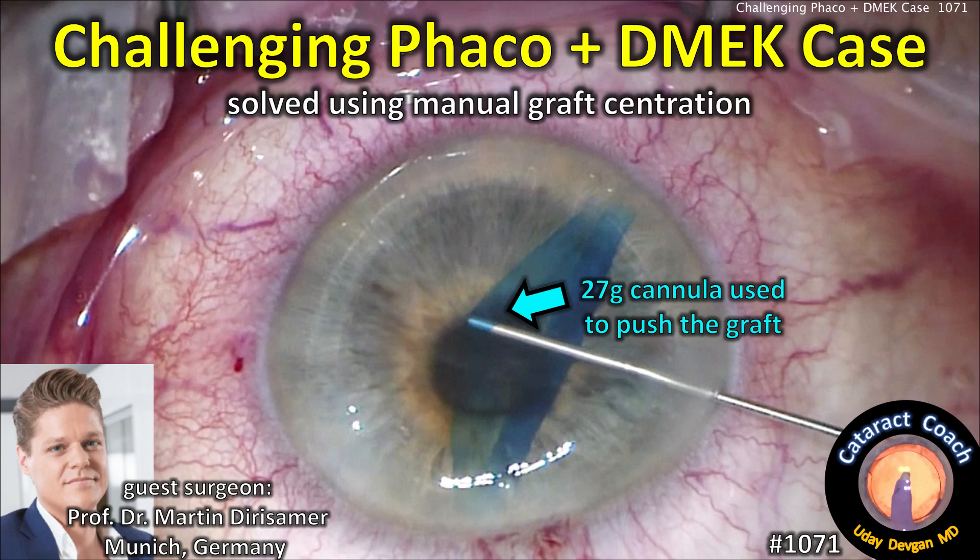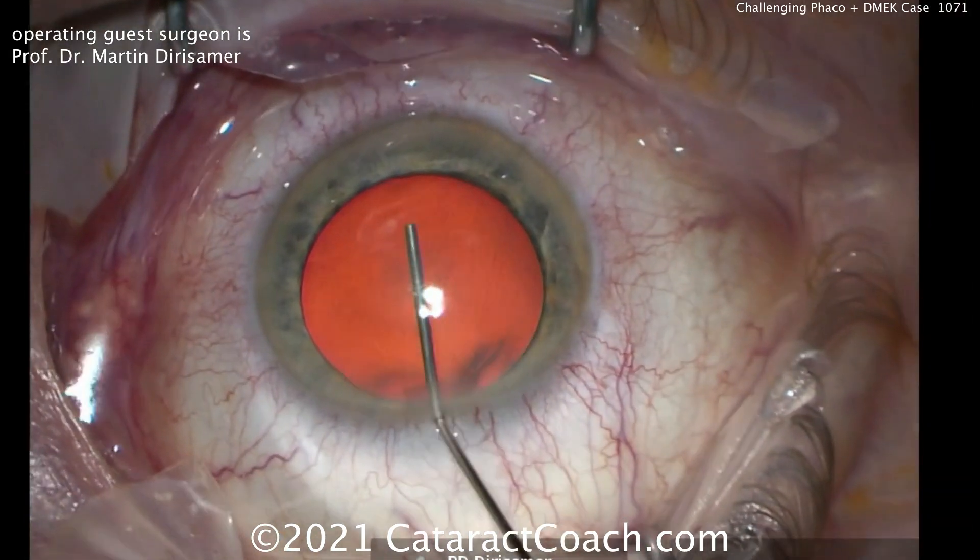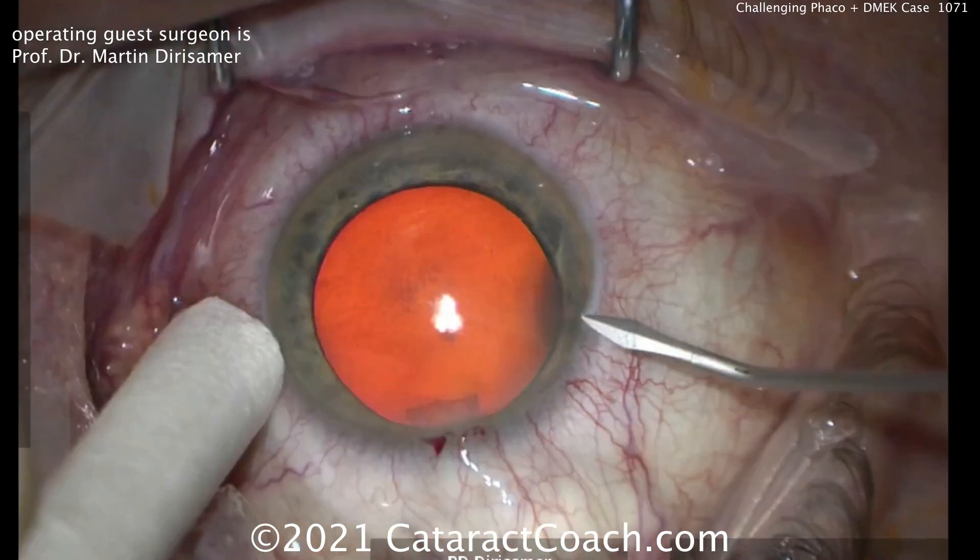CataractCoach.com, challenging FACO plus DMEC case, solved using manual graft centration. The guest surgeon is Professor Dr. Martin Derisamer, and I've learned so much about DMEC from watching his videos.